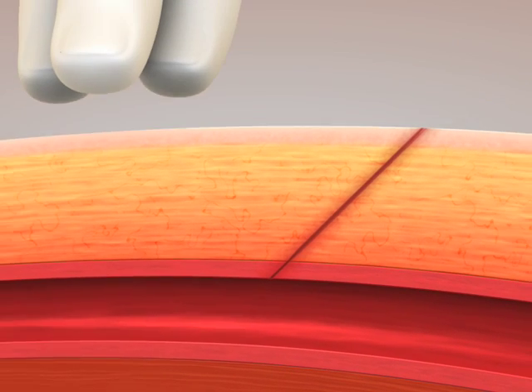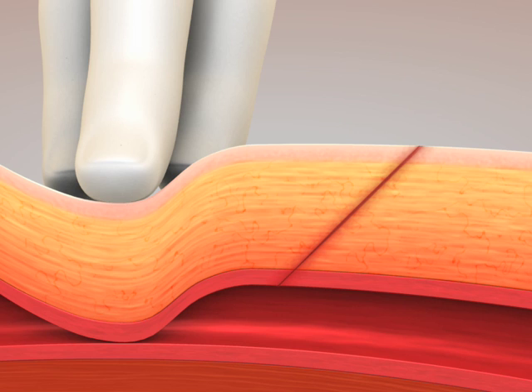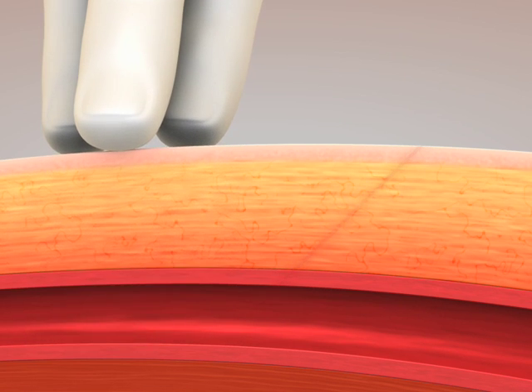As a natural consequence of elastic recoil, the tissue of the vessel is allowed to oppose much better, resulting in a faster, stronger healing process. After the device is removed, apply hemostatic pressure to the arteriotomy site to obtain final arterial hemostasis.